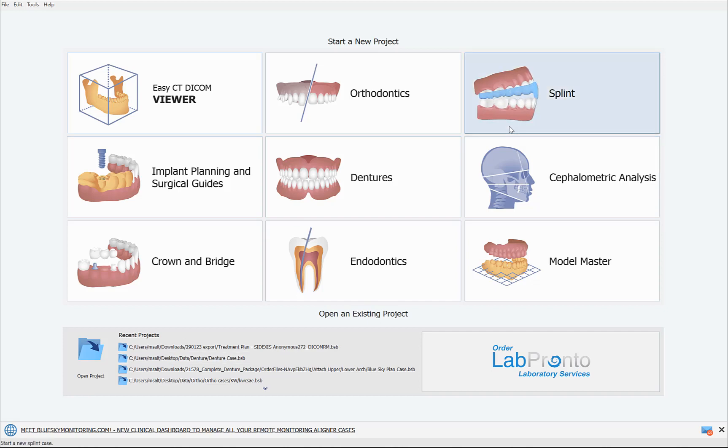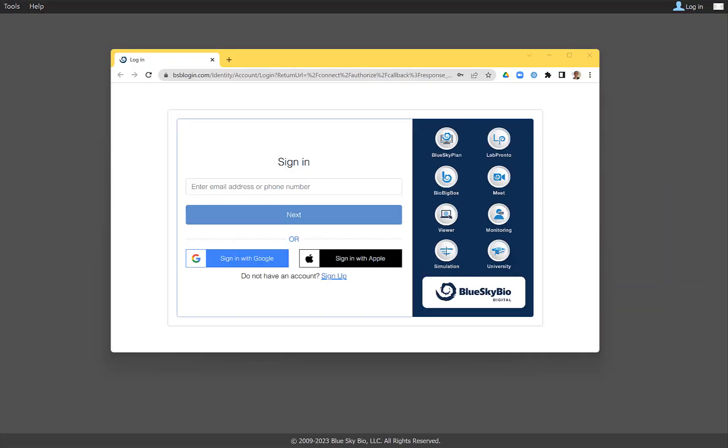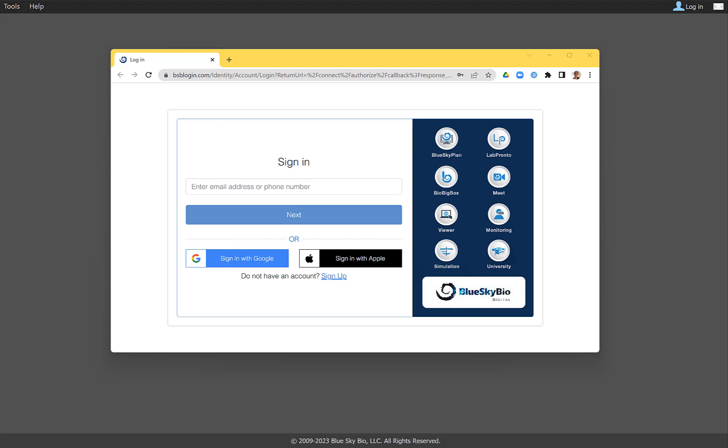Getting started with the splint module is super easy. Go ahead and click on splint. If you are asked to re-login, go ahead and do so. This is because, number one, we're increasing the security of Blue Sky Plan, and number two, we're more closely connecting your Blue Sky Plan registration to your Blue Sky Bio Digital account, so it will be a single account. To simplify the process, we've made every possible way of logging in. You could log in with your Google account or with Apple, you can enter your email address or phone number. Phone number happens to be my personal favorite.